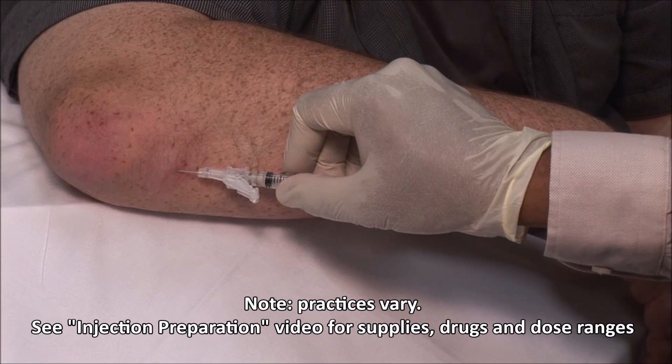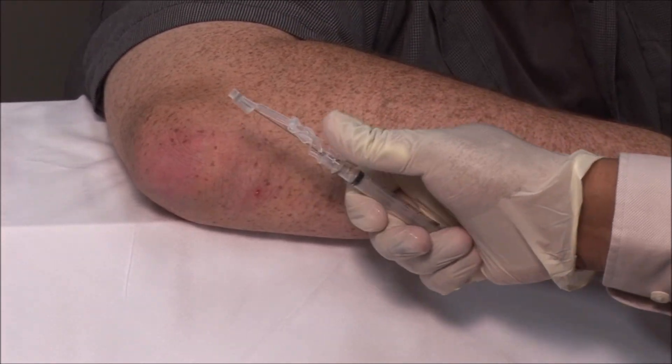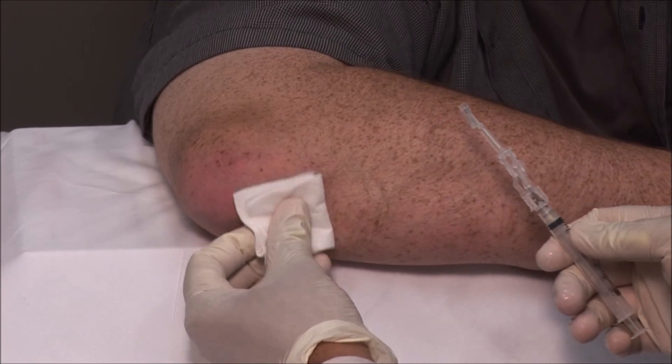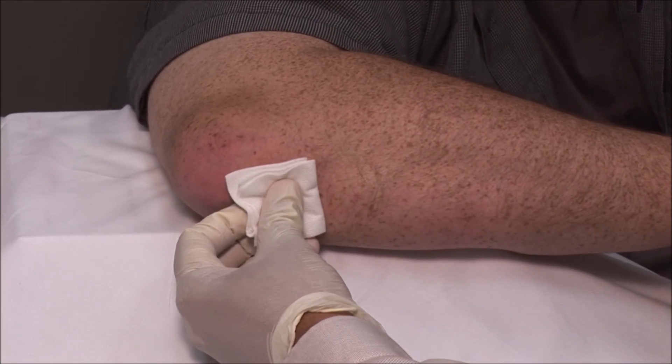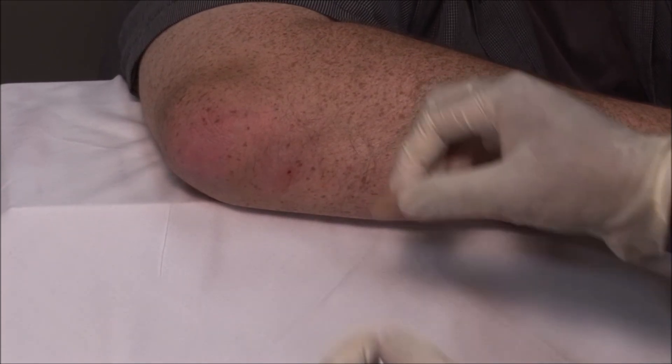Remove the needle, immediately apply the safety mechanism, dry the area and apply a bandage.